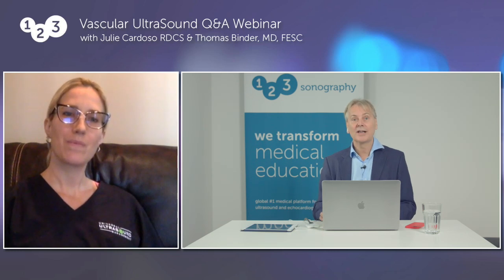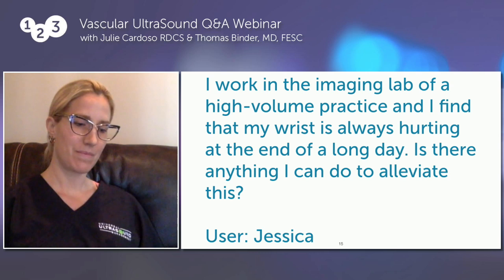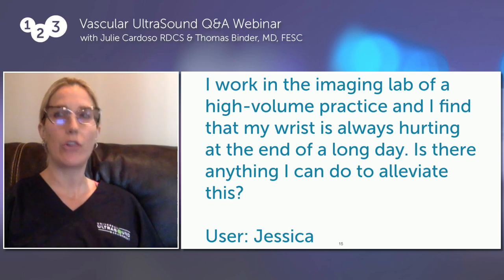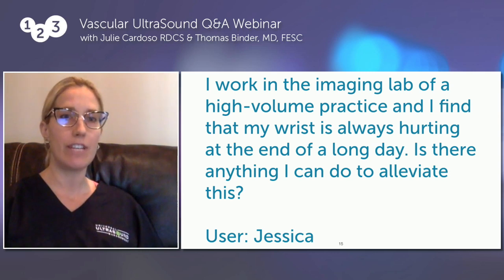which was ultrasound ergonomics. And the question here was, I work in the imaging lab of a high volume practice and I find that my wrist is always hurting at the end of a long day. Is there anything I can do to alleviate this? This was from Jessica. Julie, a problem I guess we all face. Yeah, and this is a topic dear to my heart, is ergonomics, because again, this is our career and we want to be able to practice, do an ultrasound in ergonomic ways as far as positioning our whole body. So this way we have longevity of our field.